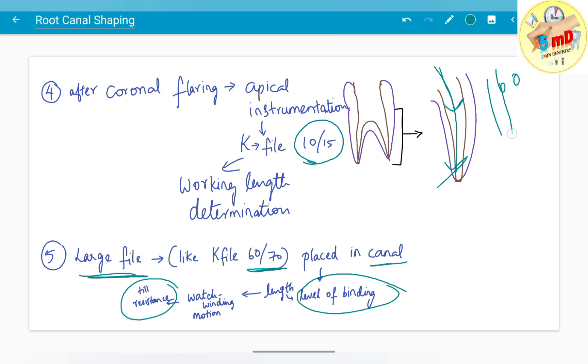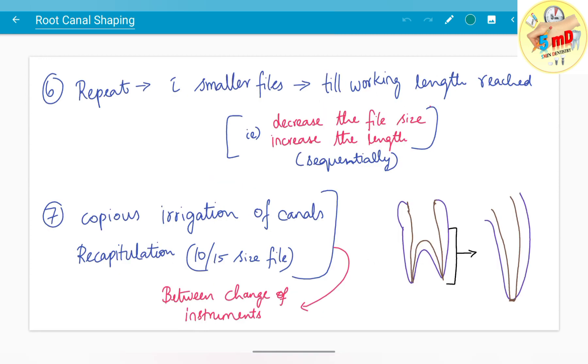You place the file not to full working length, but till where you feel binding, where the file touches the canal walls. Then do a watch winding motion, cleaning the walls circumferentially till resistance is felt. Repeat with smaller files while proceeding down. For every millimeter increase in length, decrease the file size. Copious irrigation and recapitulation with smaller file sizes 10 or 15 help prevent debris being pushed beyond the peri-apex.